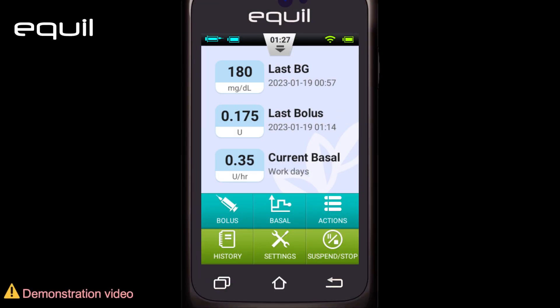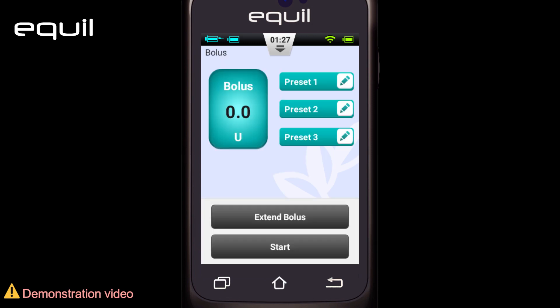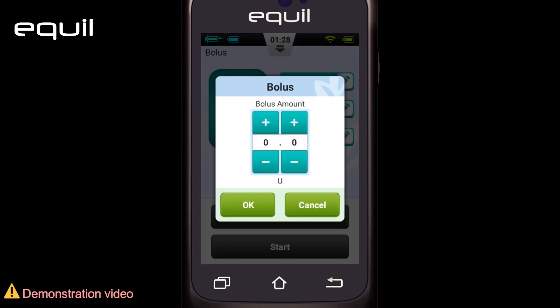Now let's talk about how to administer a bolus, which can be done in several ways. First, a manual bolus. From the home screen, choose the bolus button to enter the bolus screen. On the upper left of the screen, there's a green bolus button. We will see the bolus amount inside is zero — in this case, the start button is grayed out. Click the bolus button to open the dialog box and choose your bolus amount. Press OK.